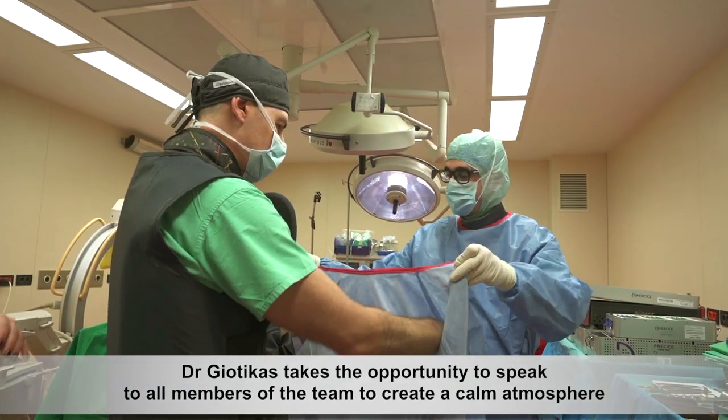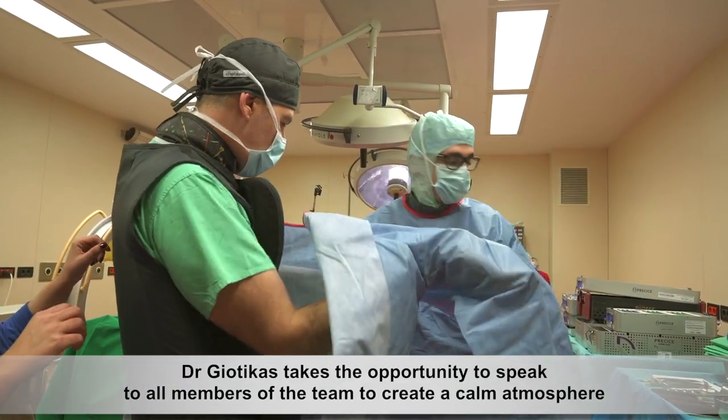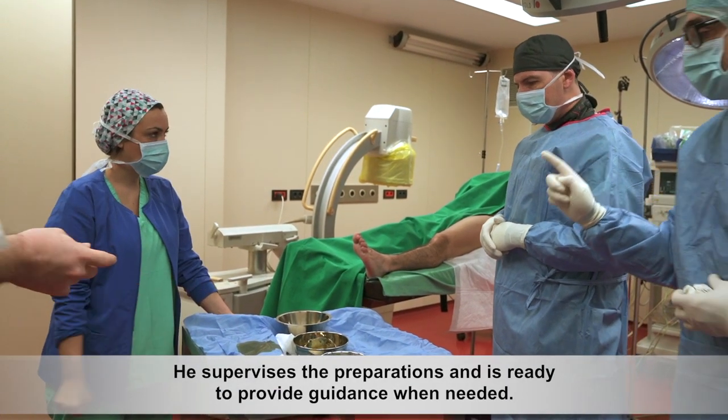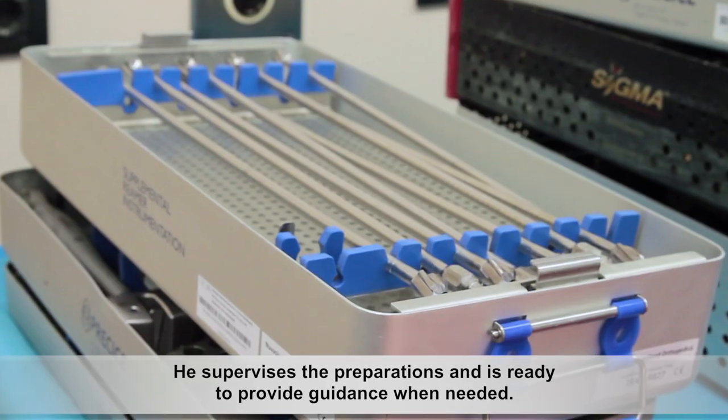Dr. Geotekas takes the opportunity to speak to all members of the team to create a calm atmosphere. He supervises the preparations and is ready to provide guidance when needed.